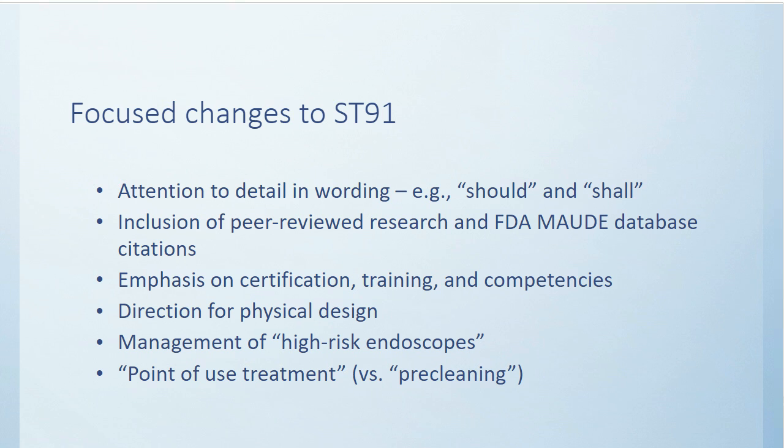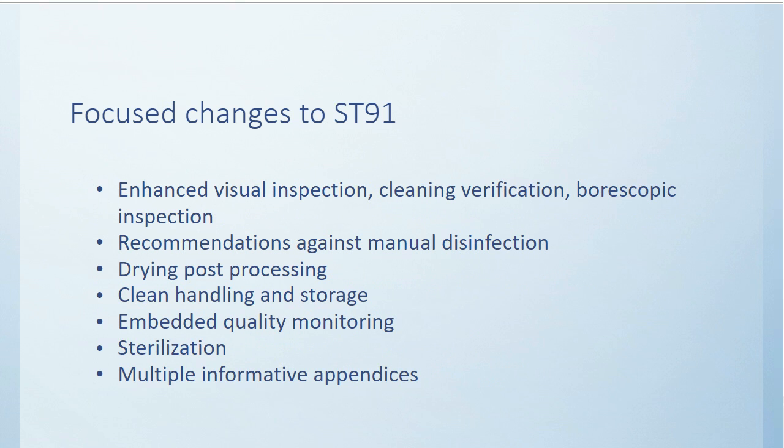We have retermed what we formerly called pre-cleaning, or what's done immediately after the patient procedure, to the point-of-use treatment, and we'll explain why. Much updated sections on inspection, including enhanced visual inspection with lighted magnification, cleaning verification, borescope inspection. We take a strong recommendation against doing any manual disinfection processes except in emergency situations. A much expanded section on drying after reprocessing, including those scopes that are coming out of an AER and those that are going back into immediate reuse.